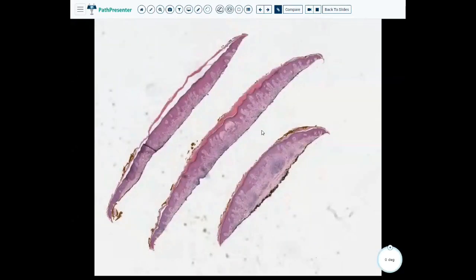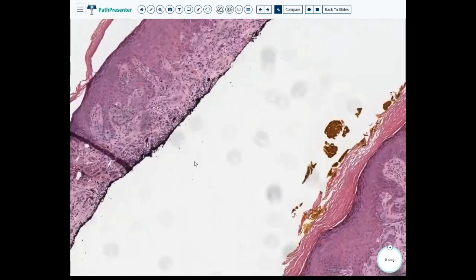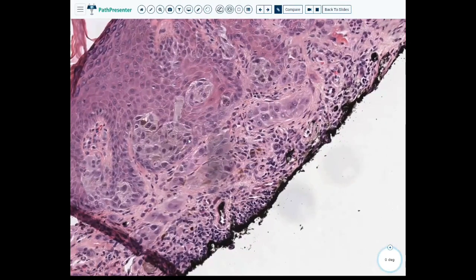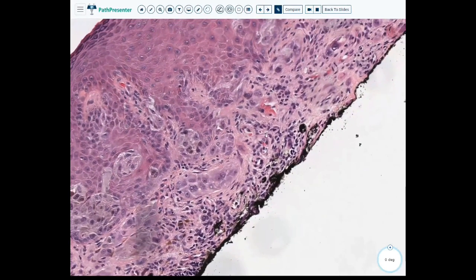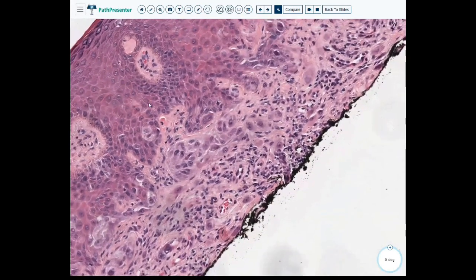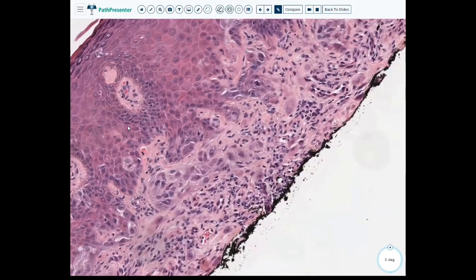Case 8. So we definitely can appreciate on this that there's something going on in the dermis, but even at low power, I can see that there's something also within the epidermis. So you probably already know where I'm going with this, so we're just going to take a look over here since I can see both components. And sure enough, we have some small epidermal nests of melanocytes. Okay, we can just kind of see those percolating through the basal layers of the epidermis.